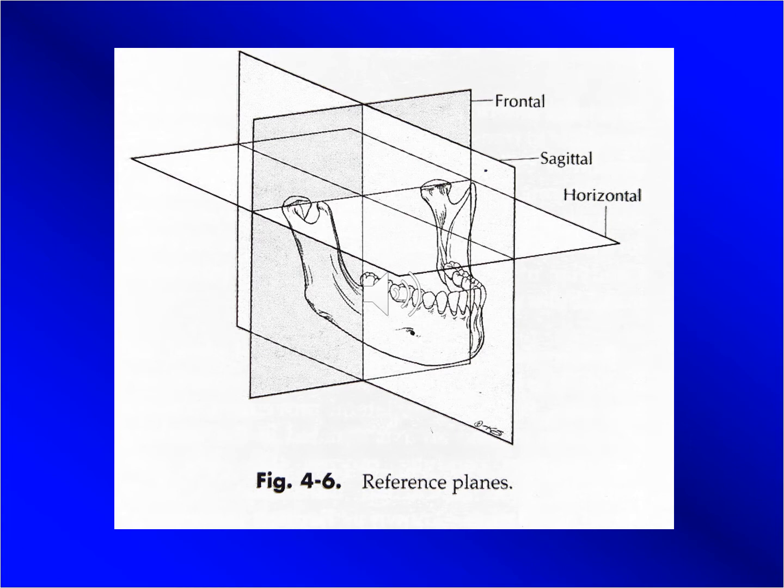And if it moves downwards, this will cause some separation closer to it. If both condyles move downwards, as happens when we do protrusion of the mandible, we'll end up with space between the posterior teeth, while the anterior teeth are still in contact in most of the cases. And that space phenomenon is called Christensen's phenomenon.